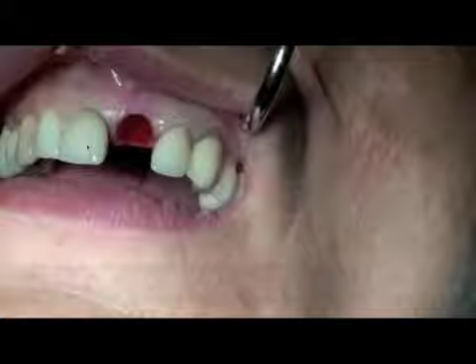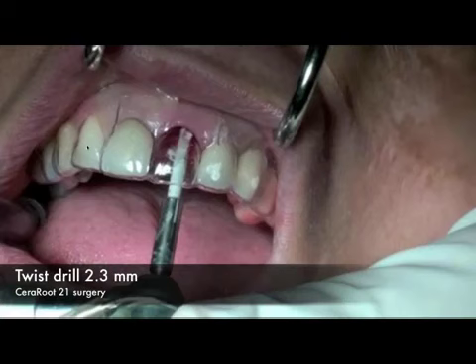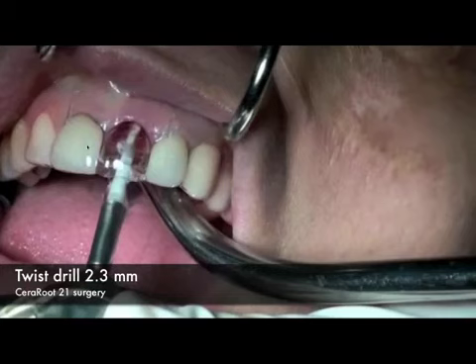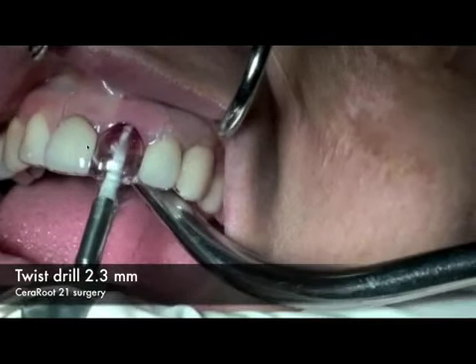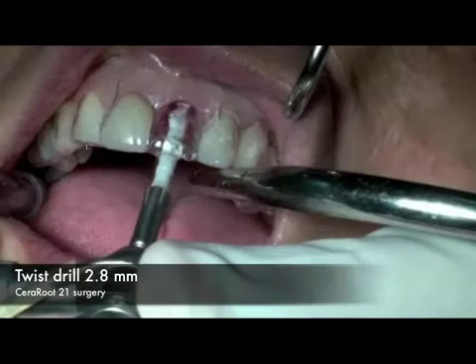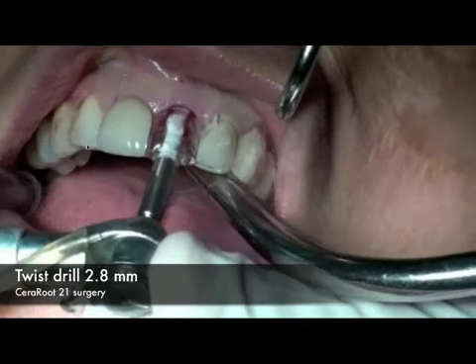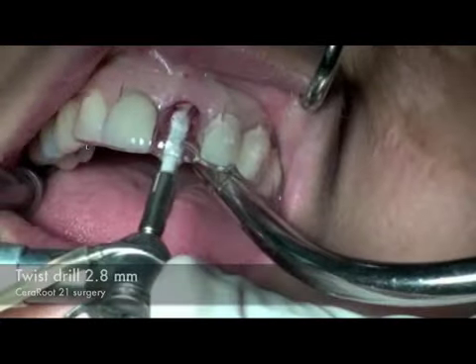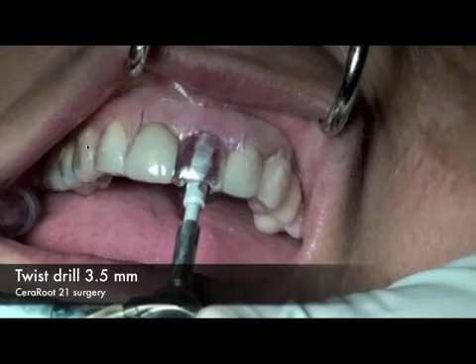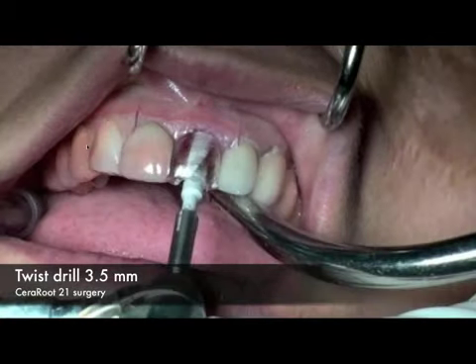We use the Essex guide to give us the inclination of the implant, and these are the ceramic drills that we're using here. The 2.8 millimeter twist drill, and once you're using this guide, you know exactly where you need to be. It simplifies the drilling process. Of course, you can use CT generated or any other generated guide to do these types of surgeries for an immediate extraction. When we know we have nice bone, this is more than sufficient.